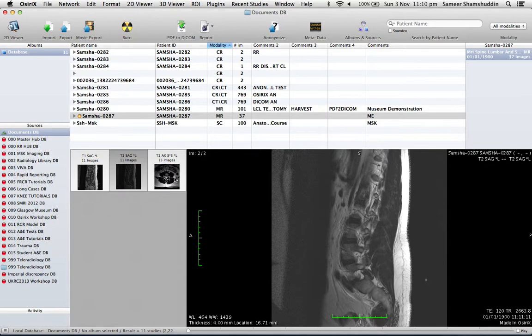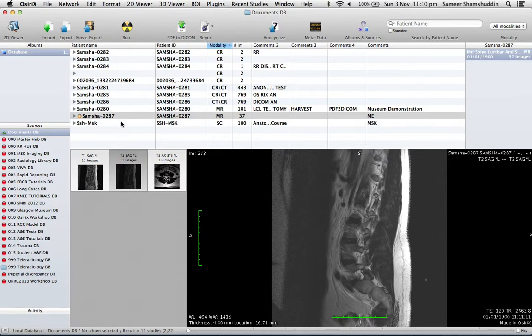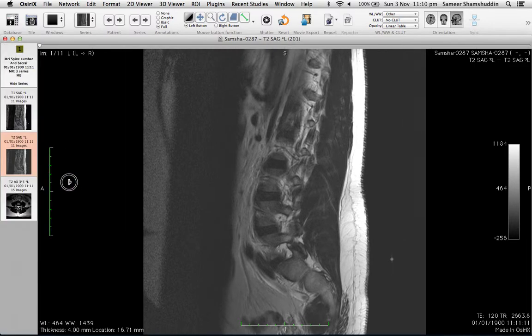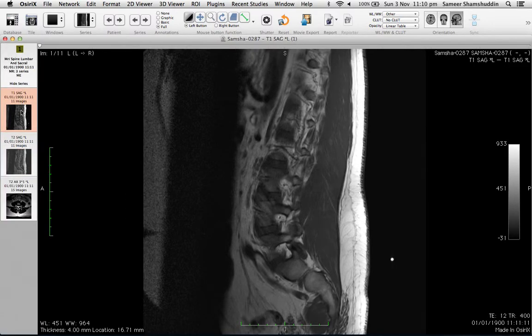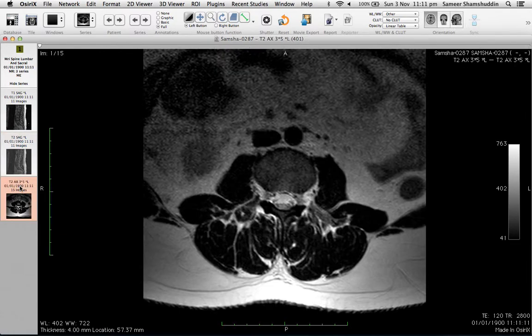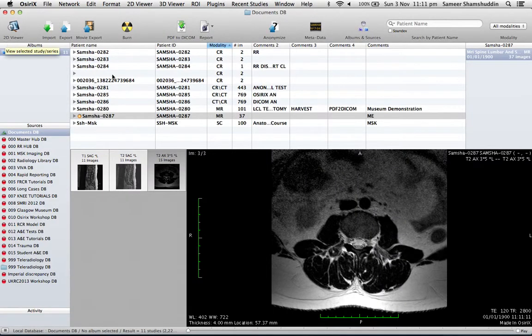But when you open a case, you will have T1, T2, and T2 axial as you decide. I hope you like this presentation. Have a series of recordings. Thank you.